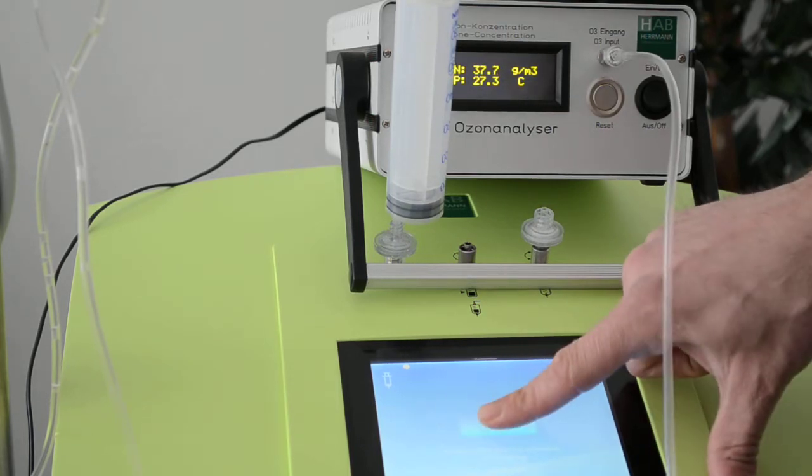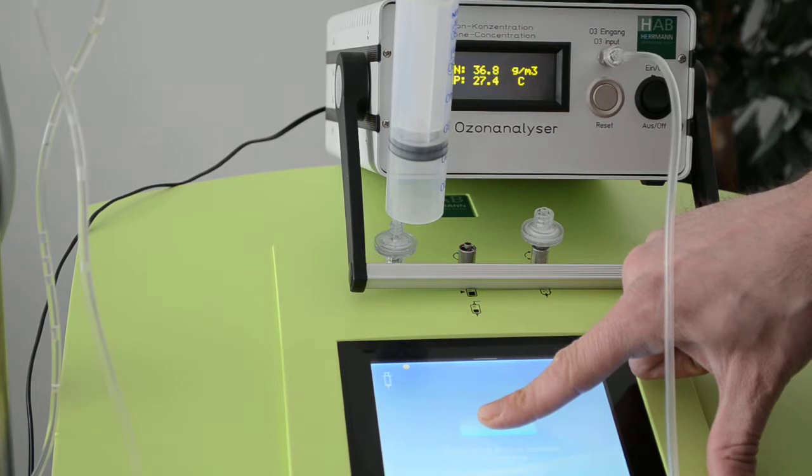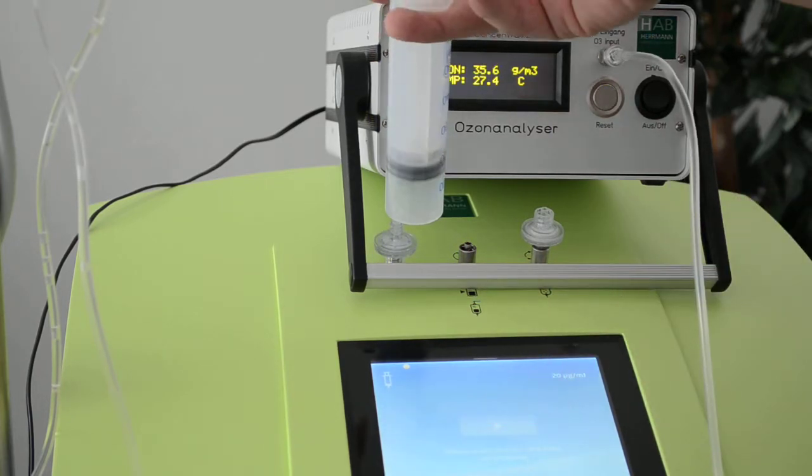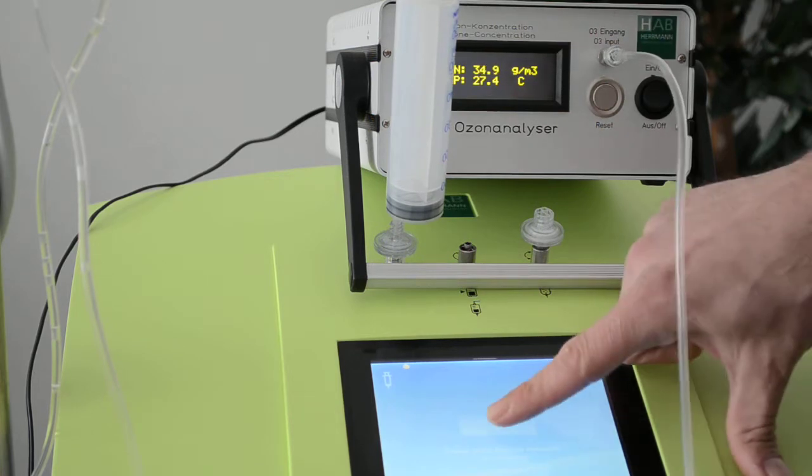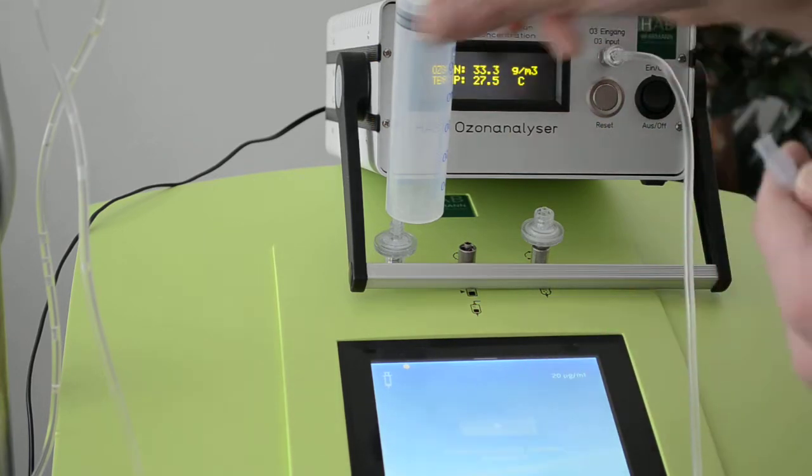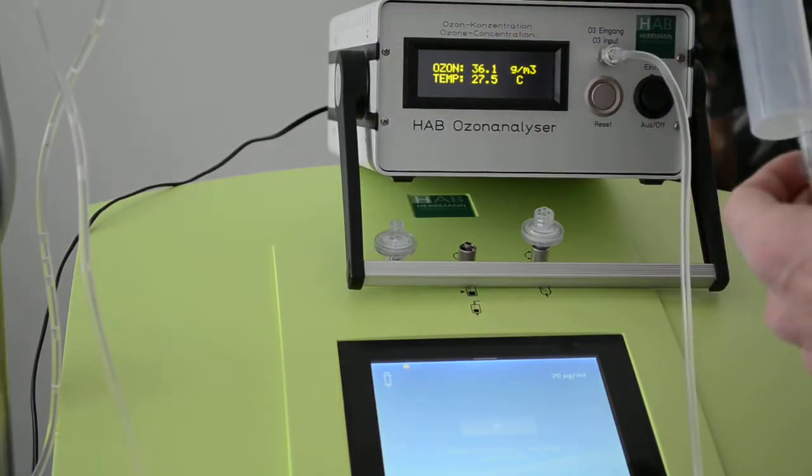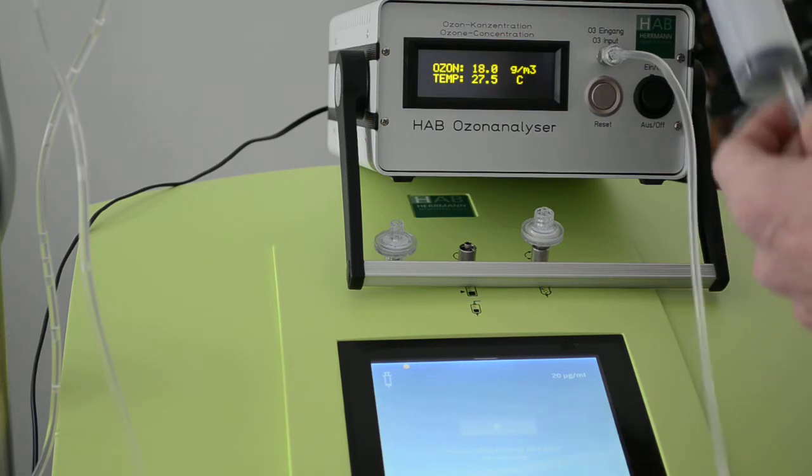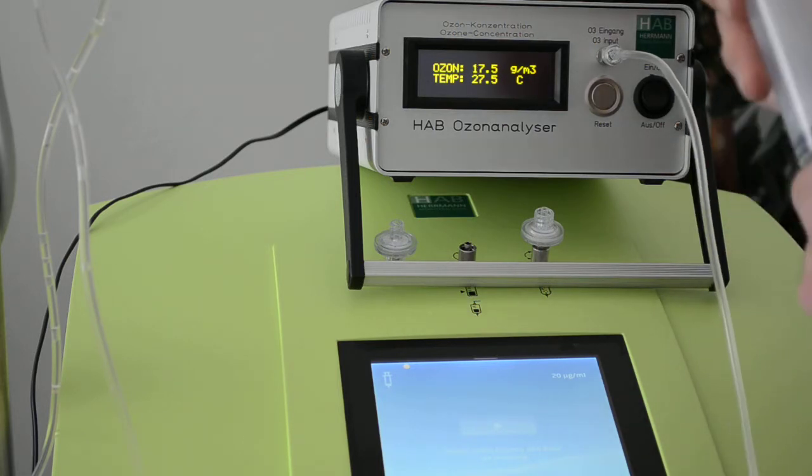We fill the first syringe and flush it. We take the second syringe. Now I take the syringe again and press it into the analyzer. 18.4, which is still in the tolerance.